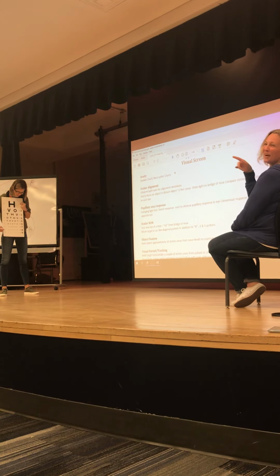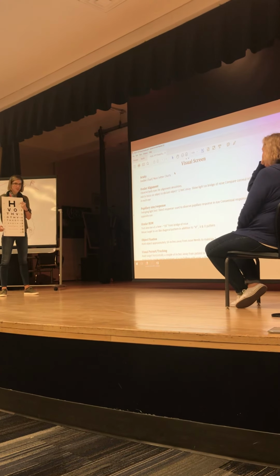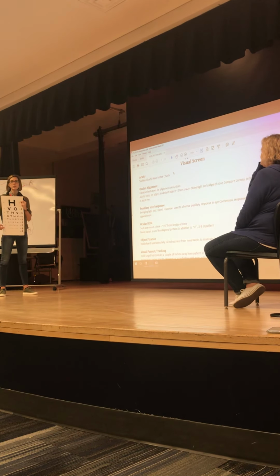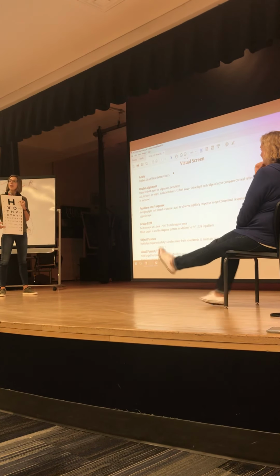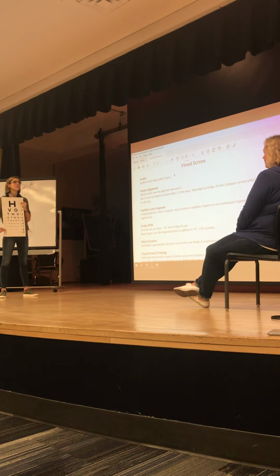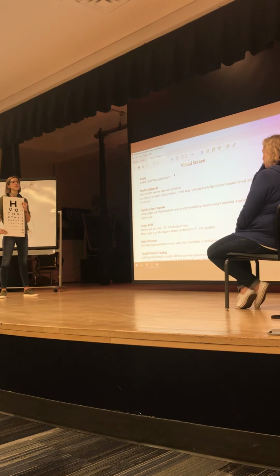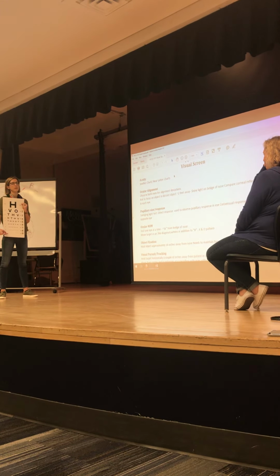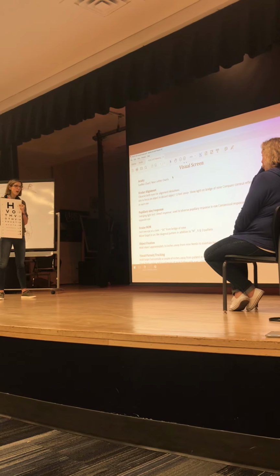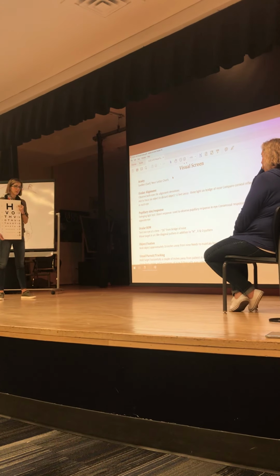I looked at it prior to. I'm not 10 feet away, but yes, that's what you're doing. So I asked for the lowest level. And when the patient reads the lowest level, I go, okay, she did it perfectly. All right, so cover that. Can you read it? How about try the one below it? No. Okay. So what I would do is say, why don't you try it? I want you to have an error.